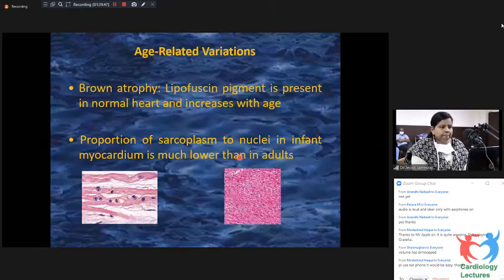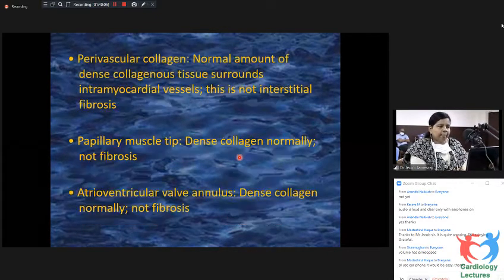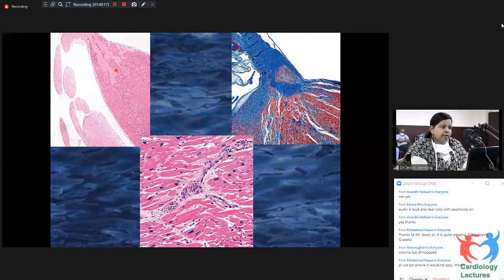Coming to the myocardium. Myocardium consists predominantly of cardiac muscle cells, which are 120 microns long and 20 to 30 microns in diameter in a normal adult. Each cell has one or two large nuclei occupying the central part of the cell. The cells are branched at the ends, and the branches of the adjacent cells are so tightly associated that their appearance under light microscopy is of a network of branching and anastomosing fibers. Cells are bound together by elaborate junctional complexes, the intercalated discs.